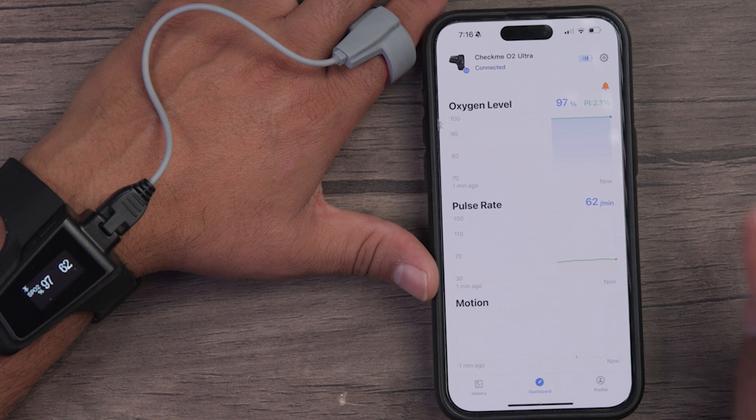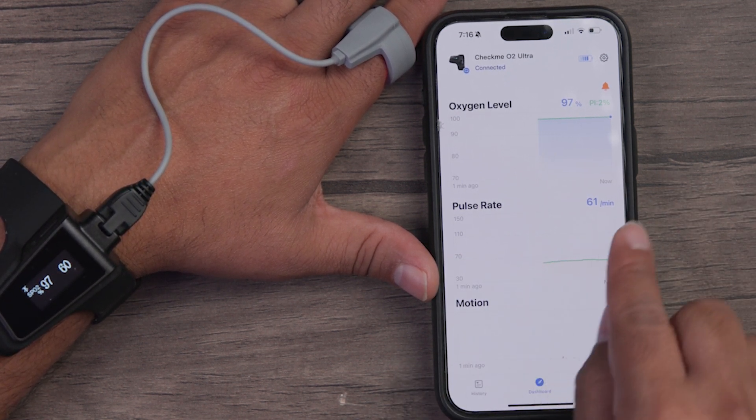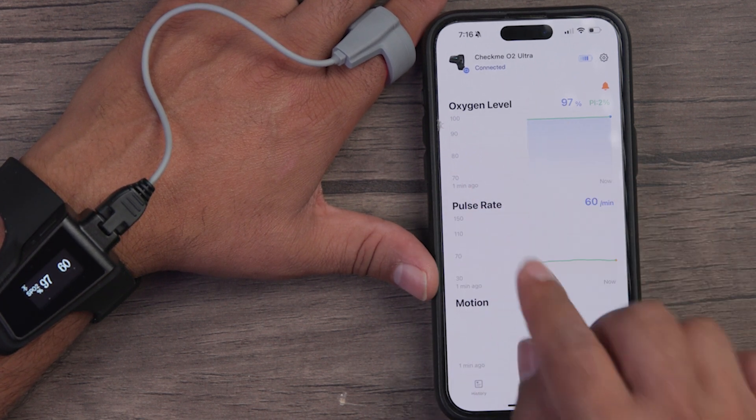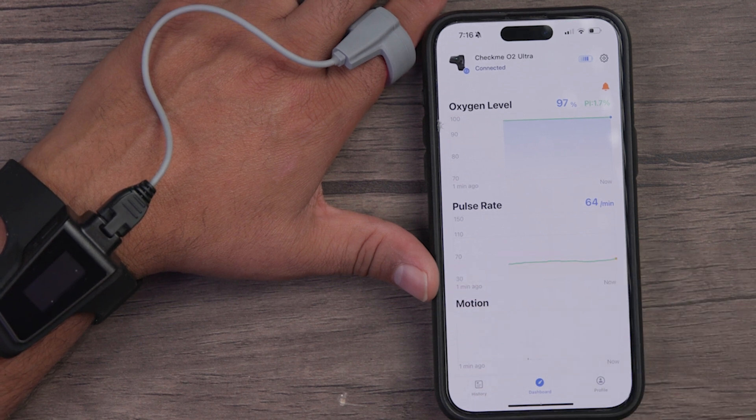I did mention app support, so let's check that out. On the dashboard, you can see it is tracking our oxygen level, our pulse rate, and our motion at the same time. There's a timeline, and through that timeline we can see what percentage it's hitting during each time period — the same thing with the pulse rate as well.